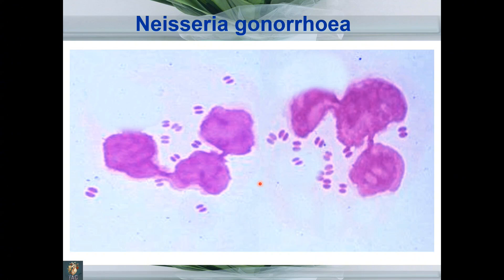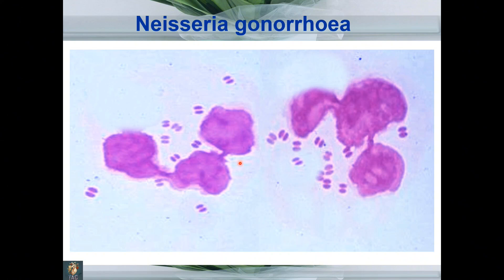Another slide shows Neisseria gonorrhoeae. The most important feature is that it is gram negative — you can appreciate the pink color as compared to Staphylococcus aureus. Note the arrangement: these are gram-negative diplococci — not in clusters, not in chains, but in pairs. If you place two coffee beans alongside each other, you get this image, which is typical for Neisseria gonorrhoeae.